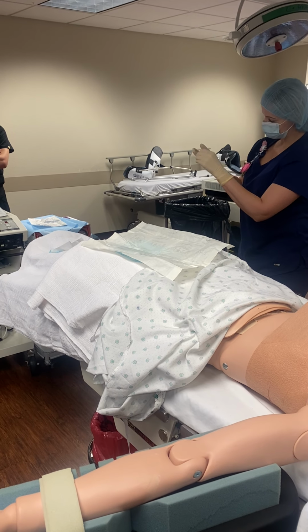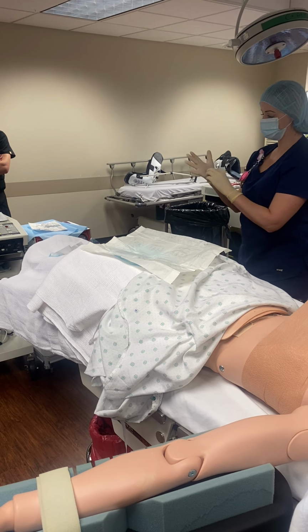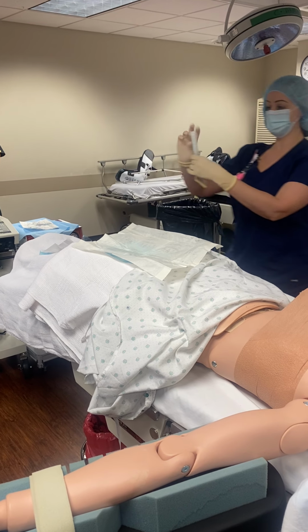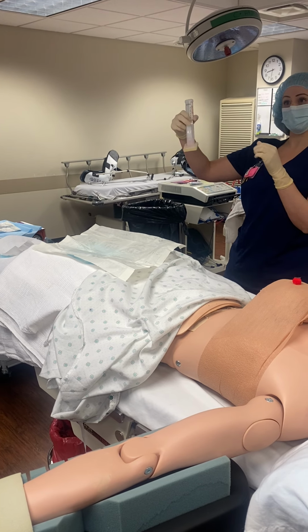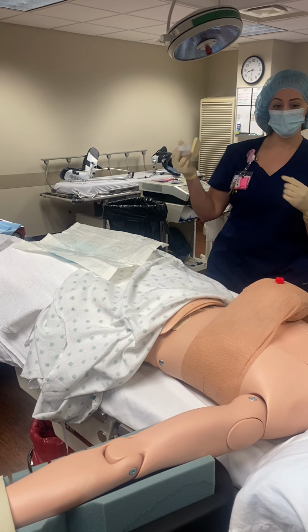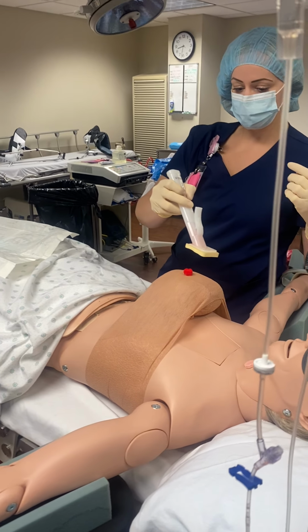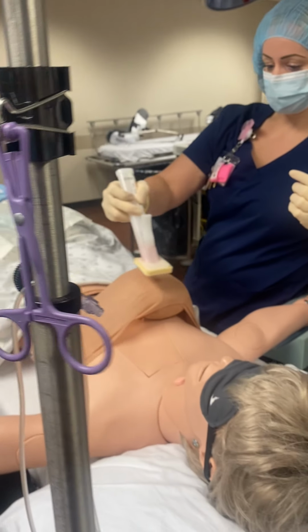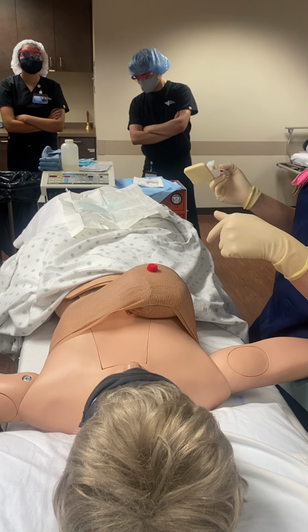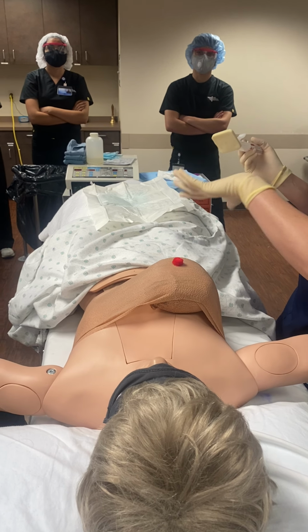Thank you. I pretend this glove doesn't have a hole in it. So you'd have sterile gloves on, and then you would grab the ChlorPrep stick, and when you push this part in, it cracks it, everything mixes, and then it's going to start filling up an orange color there. You always want to start at the incision site, and then you work your way around it. So you never go back over the incision site or the site you started with after you're in the dirtier area.